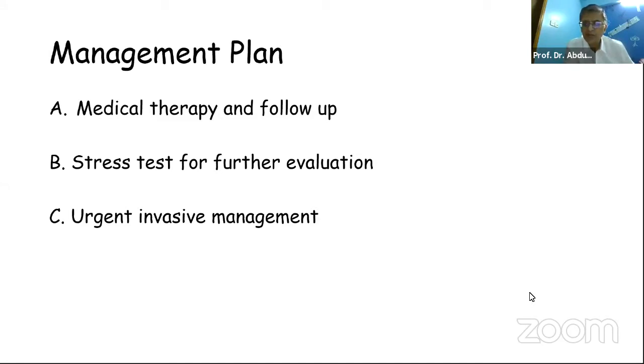Hafiz Bhai, your comment, please. So, I tell this patient should not go to the stress lab. And it is very important to recognize, as you know, that even in unstable angina, the coronary anatomy and physiology matters. Because unstable angina due to a diagonal problem or an OM problem or a PDA problem is one thing. But unstable angina due to proximal LAD, if you look at the whole cardiology database, has mortality implications. So it is very, very important that we recognize this. Otherwise, the patient's life can be at risk.